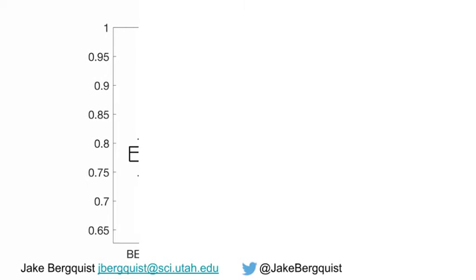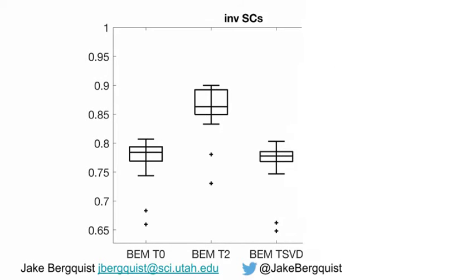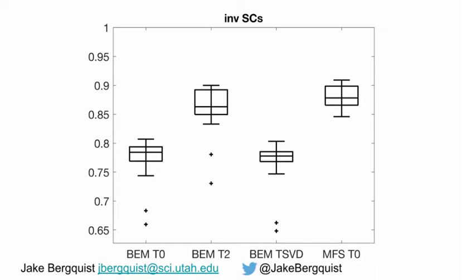Next up is spatial correlation. This is the correlation between measured and reconstructed potential maps averaged across all time instances for a single beat. We can see that while all methods show quite high spatial correlation, Tikhonov's second order with boundary element method and MFS with Tikhonov zero order showed the highest.